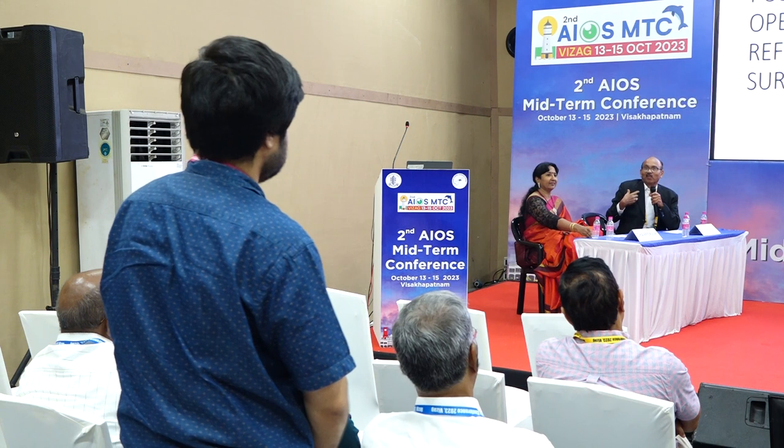I am better than phaco, I am telling. Phaco fellows cannot correct the astigmatism. I can correct astigmatism. At the same time I am a phaco fellow, and at the same time I am a femto fellow. But I can correct my astigmatism, but not with phaco. With phaco, I always advise toric lenses.